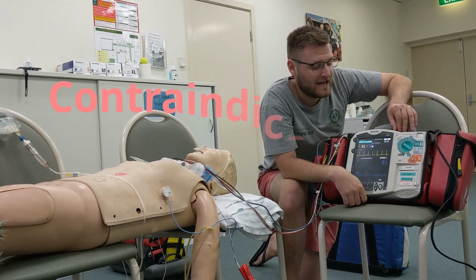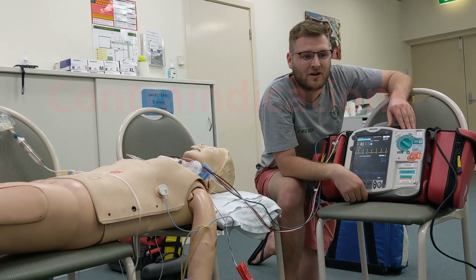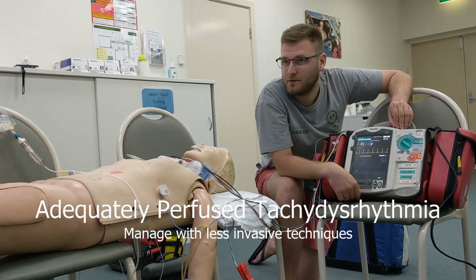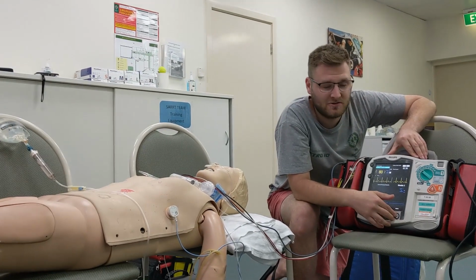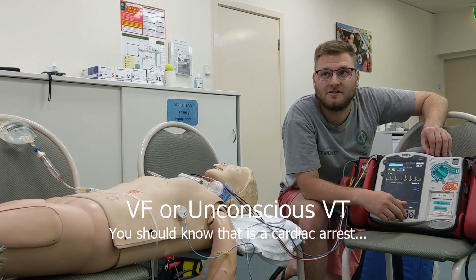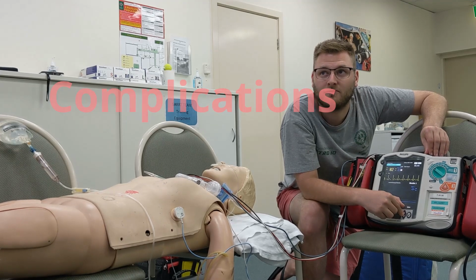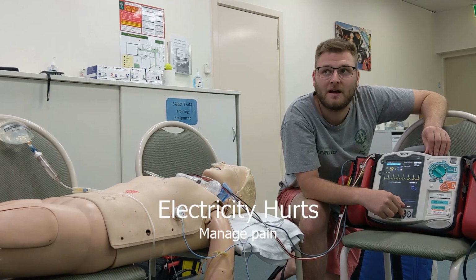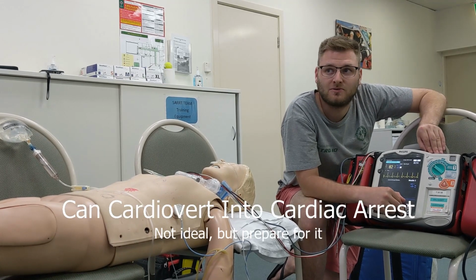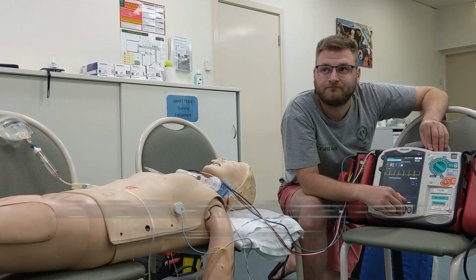There are some contraindications for synchronized cardioversion. Obviously, a patient who has a tachydysrhythmia doesn't automatically qualify for it if they're adequately perfused. And if they're in a ventricular fibrillation or in a pulseless VT, well, then that's a cardiac arrest, and you need to manage that as such. Complications include, obviously, shocking through the chest is pretty painful and uncomfortable for patients, so you need to manage that. You can potentially also shock into a cardiac arrest, which is not ideal.